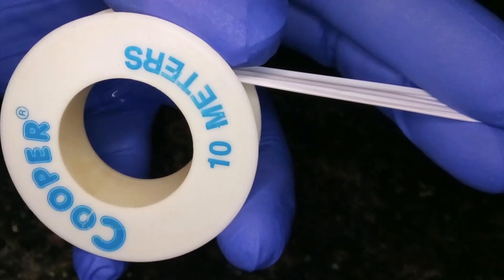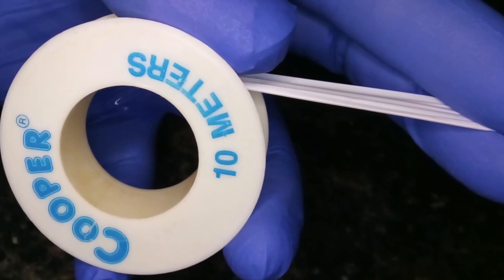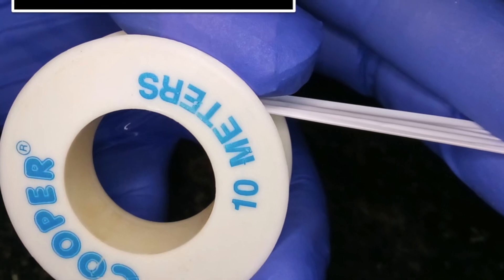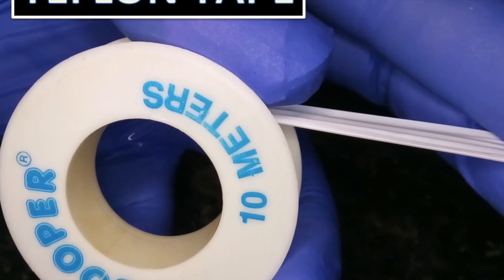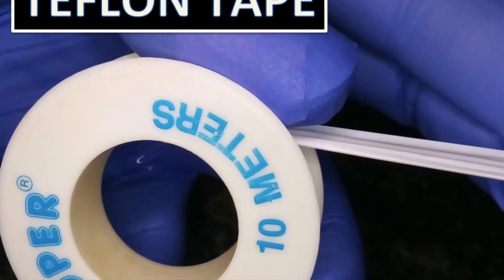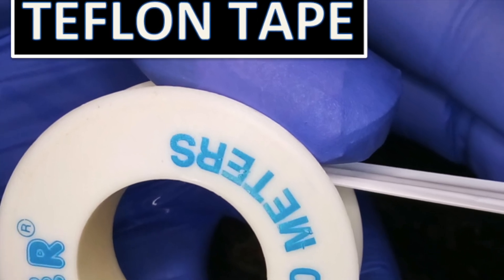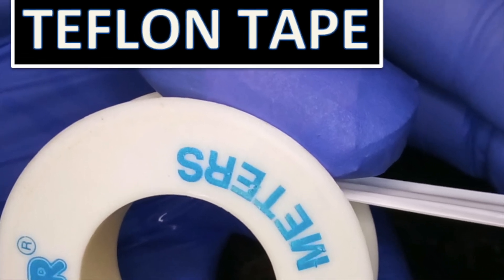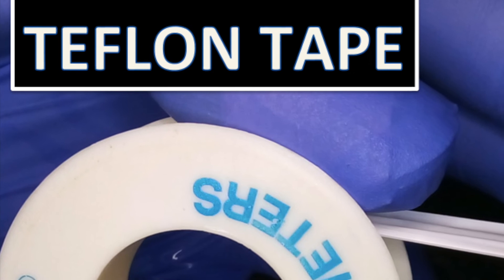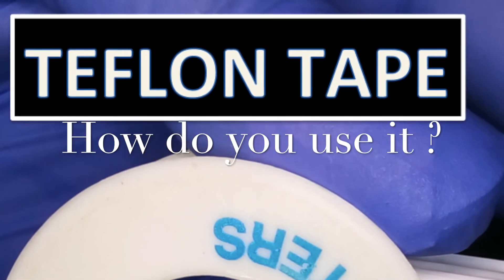In order to prevent the restorative material from entering the chamber, you can use many things like cotton, sponge, or a piece of gauze. But I like to use plumber's tape or teflon tape, as it does not have any fibers that can get trapped either on the tooth surface or the restoration surface.